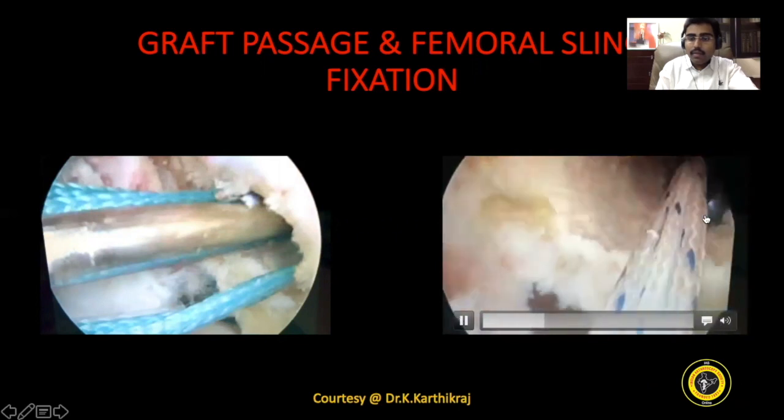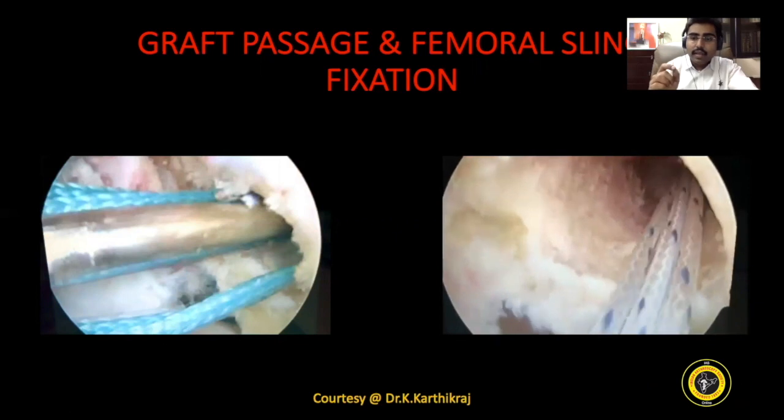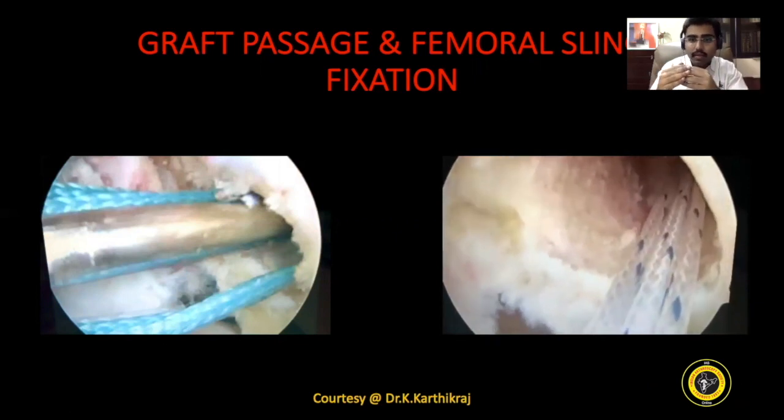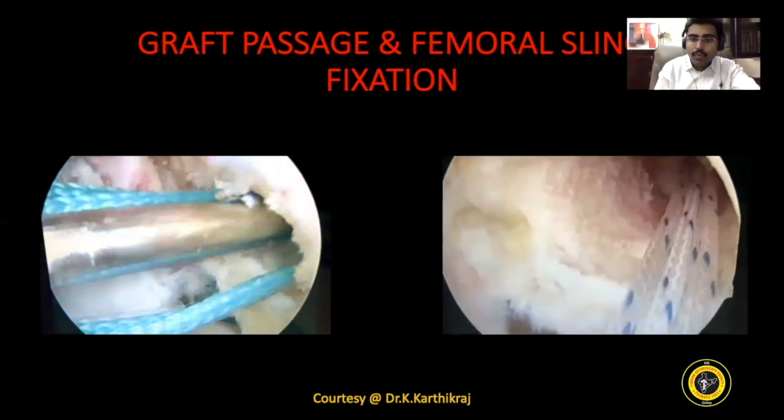snugging to the femur. Now that's more important. I like pulling the Ultrabutton in a very gentle fashion. That helps prevent the sudden flip-off of the Ultrabutton getting stuck into the soft tissue. Now let me show you.